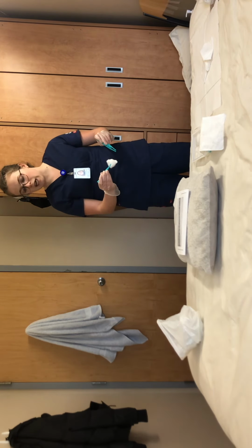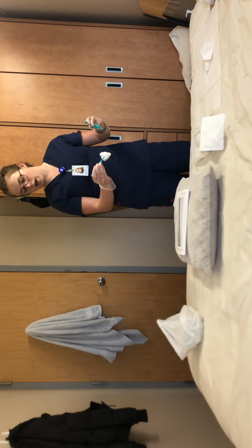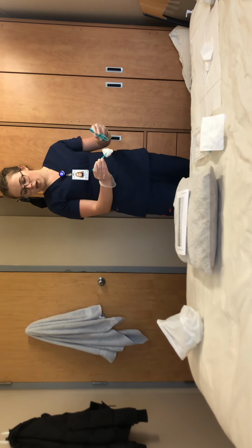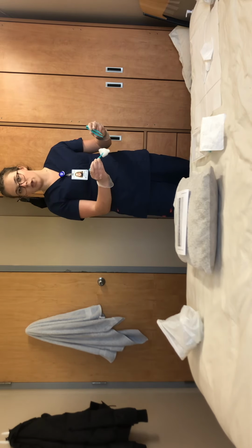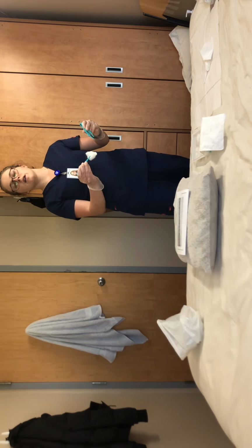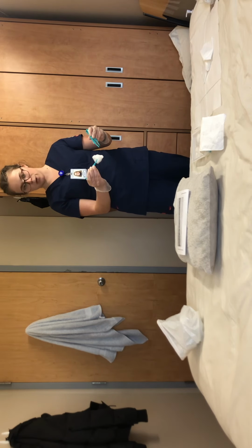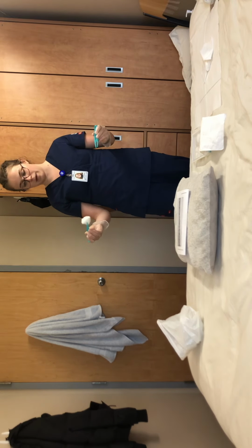And before I begin cleaning, I would assess the wound, and I would state that it is a surgical incision with 10 staples. It is closed, and the peri-wound surrounding it has no erythema, no callus, no maceration, and no induration. Then I can continue with cleaning my wound.